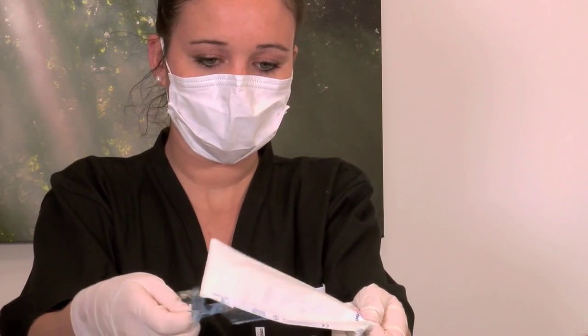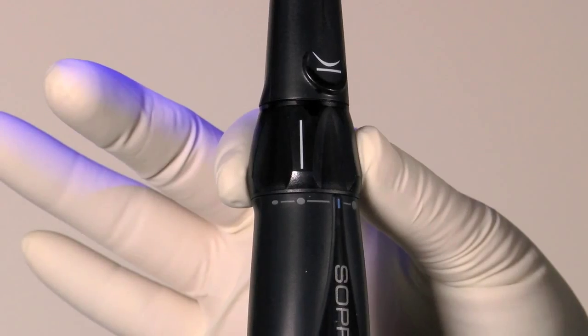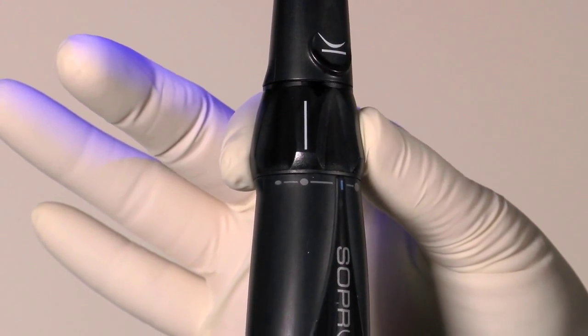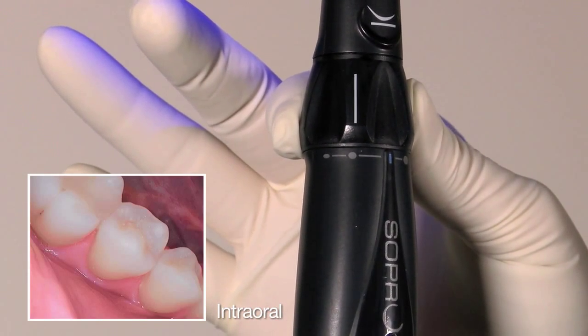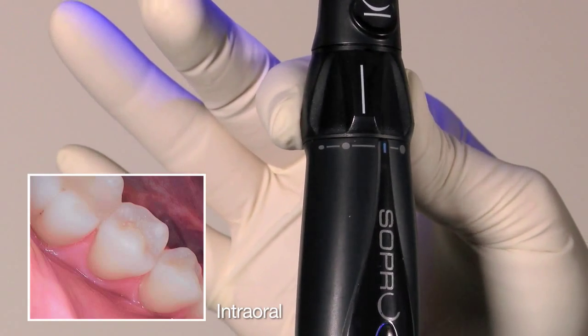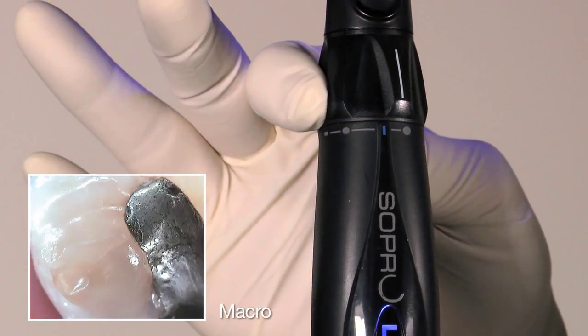Place the autoclavable SOPRO tip on the camera handpiece. Choose the desired position on the focus ring: extra oral, intraoral, one tooth, and macro.